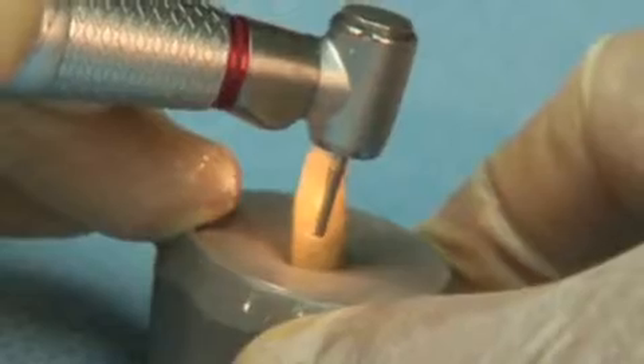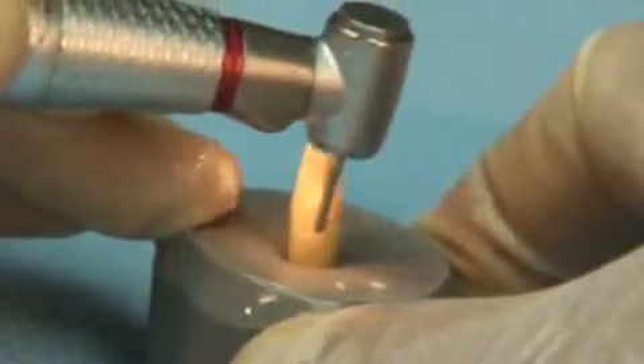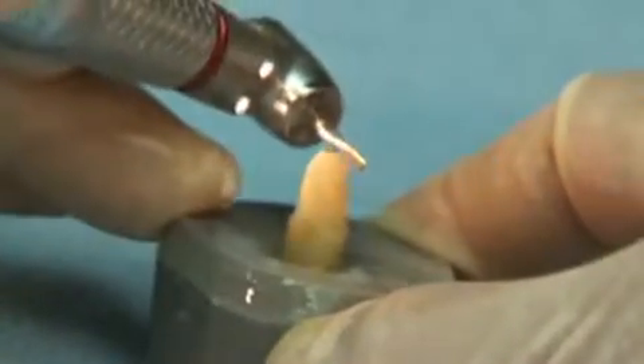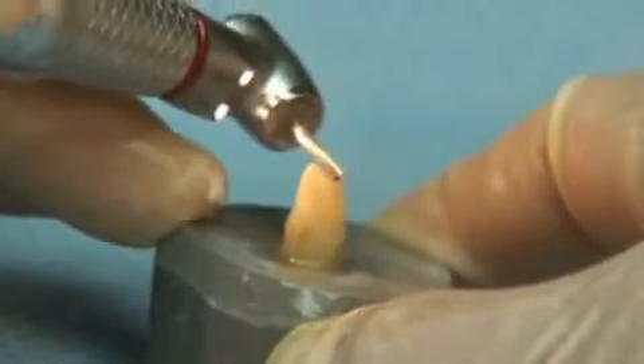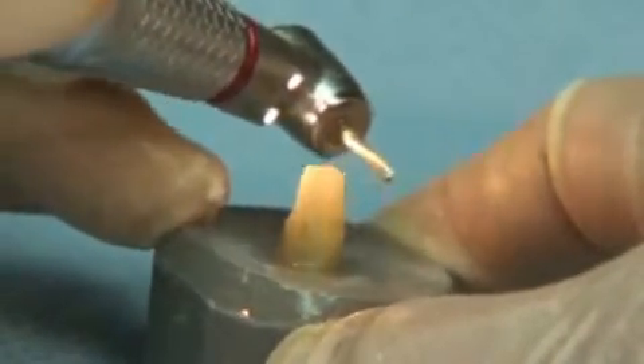Great White Ultra will cut crown preparations that have existing old restorations in place at a fraction of the time when compared to a diamond instrument. The highly serrated blades of the Great White Ultra have been shown in an independent study to cut significantly faster and with less effort than comparative diamond instruments. This reduces chair time on crown preparation and improves patient satisfaction.